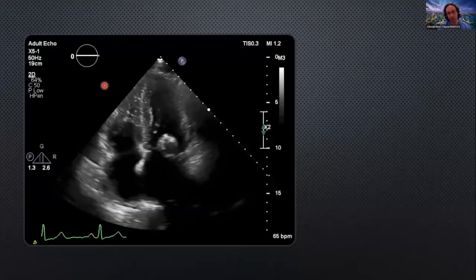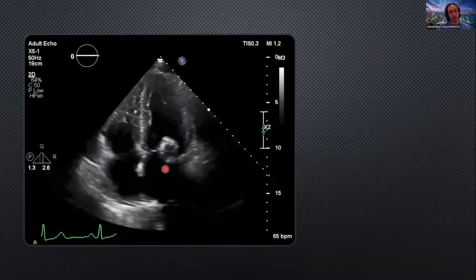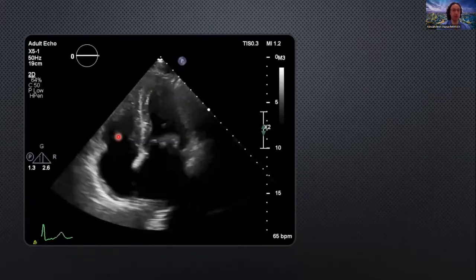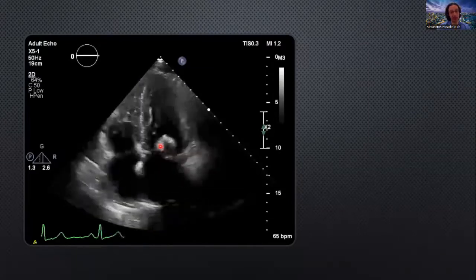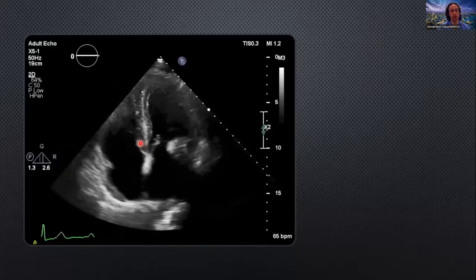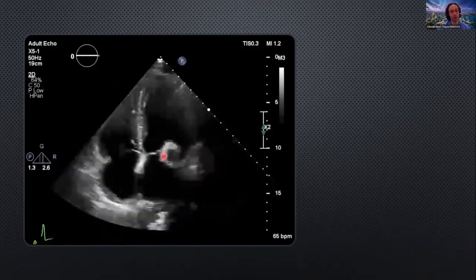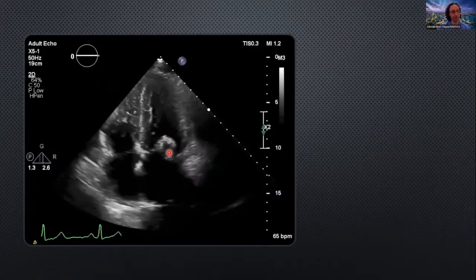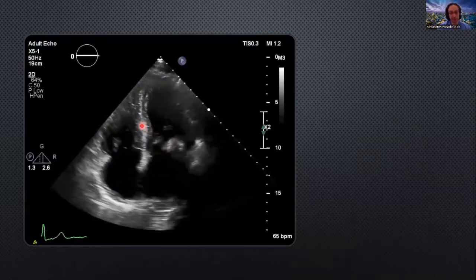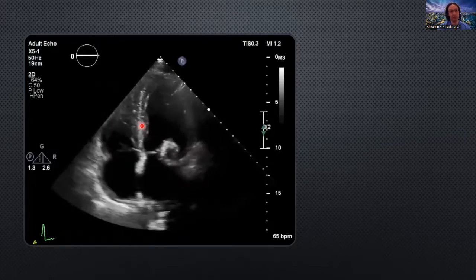So it was not clear why this patient had a stroke, with just atrial fibrillation. But some patients with this calcification have thrombi sitting on it, which may be a source of embolism for the stroke, or even calcific debris from the calcium can go into the brain. There have also been cases describing a rupture of the capsule, and the lipid core related to circulation can cause embolic events. So we thought it would be a good idea to do some contrast and see if there's any communication between the core of the calcification and the cavity.